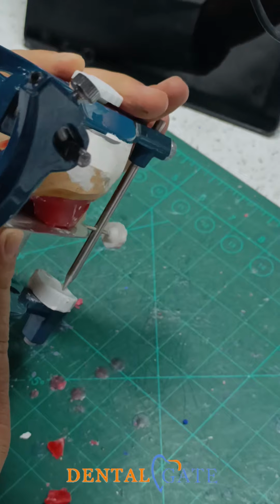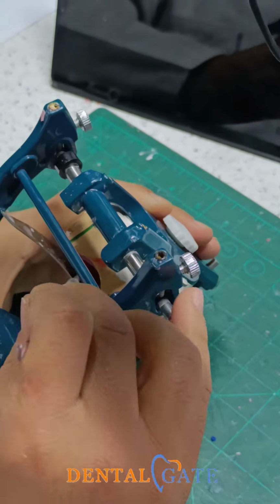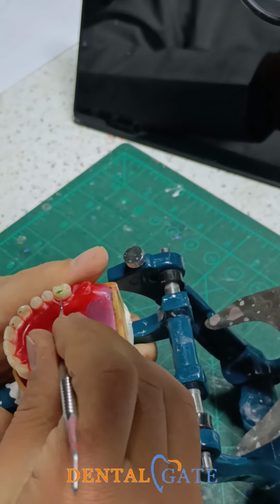So this is what I mean now. There is a contact just in the palatal cusp, that means the functional cusp.